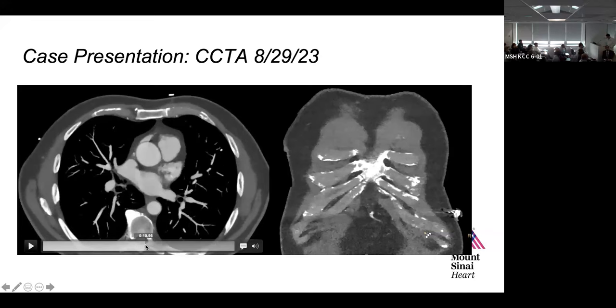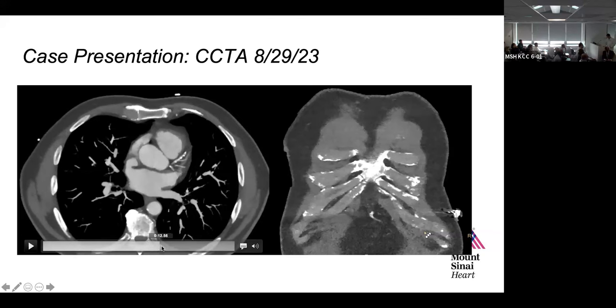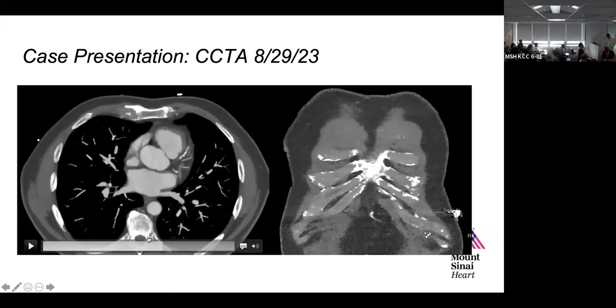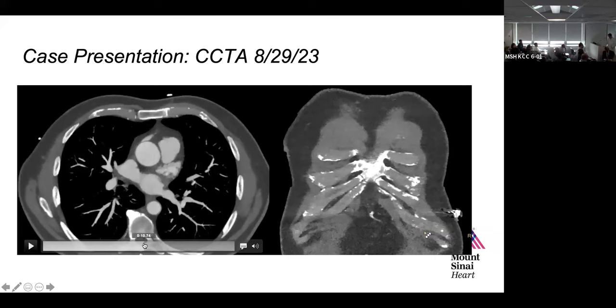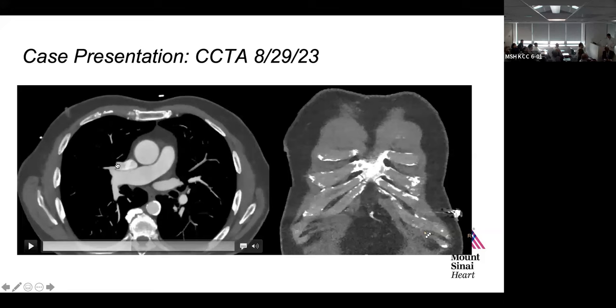And it seems like the right lower vein is actually not anomalous. It's coming straight into the left atrium. So I think the left-sided are normal. Right lower looks okay, up right there. Left-sided are okay. And really the two anomalous veins are the right up and the right middle that are coming in at where the SVC-RA junction is.